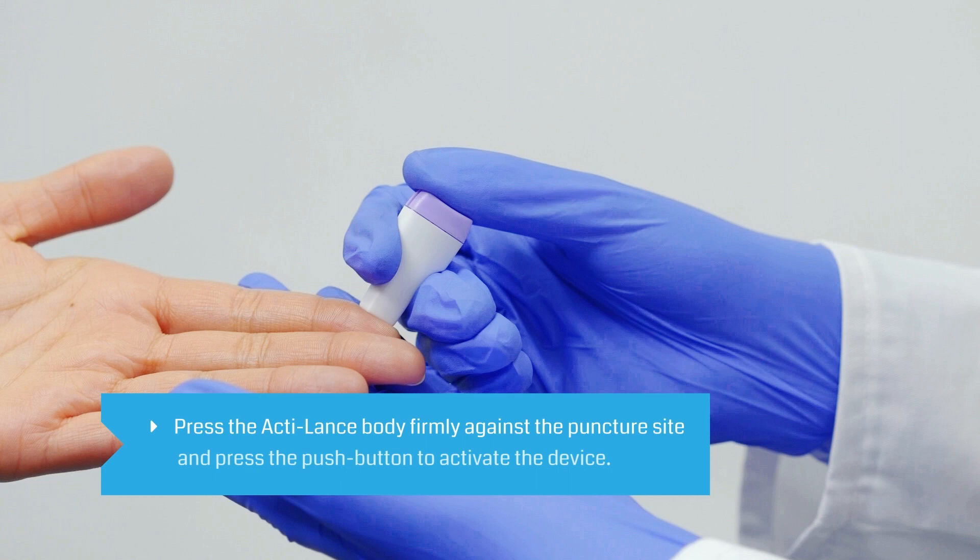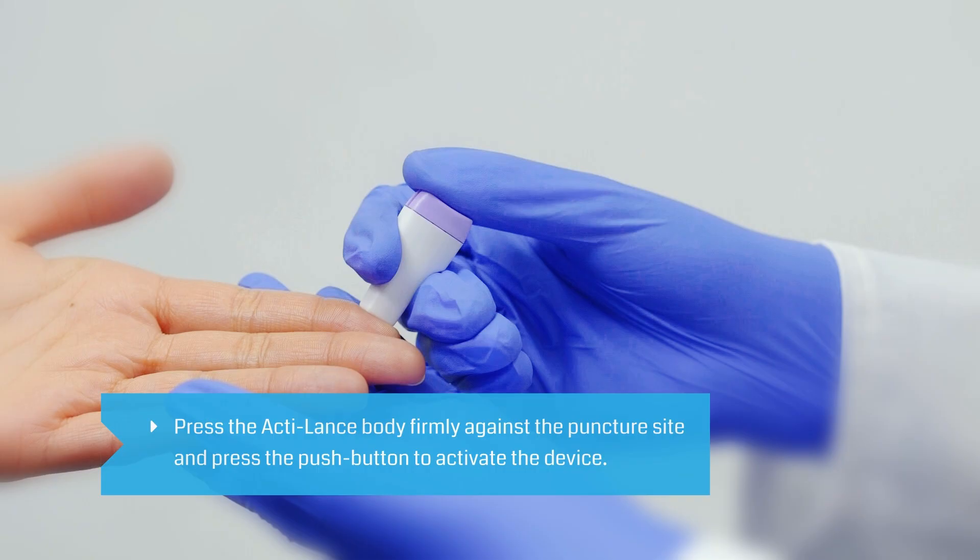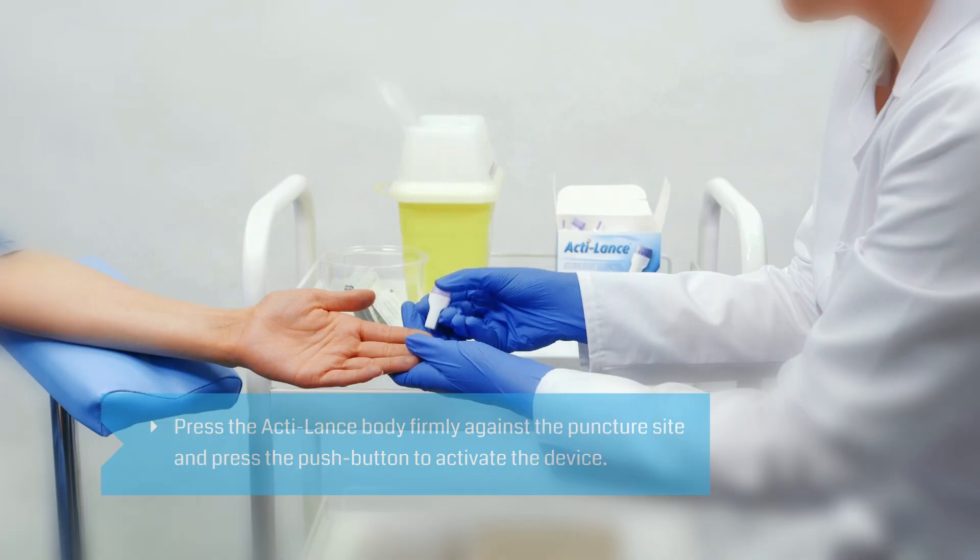Press the safety lancet body firmly against the puncture site to activate the device. Discard used safety lancet in accordance with your local regulations.